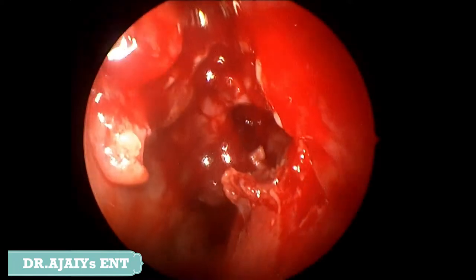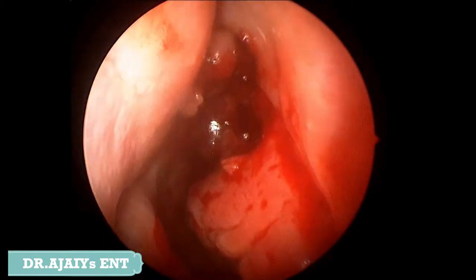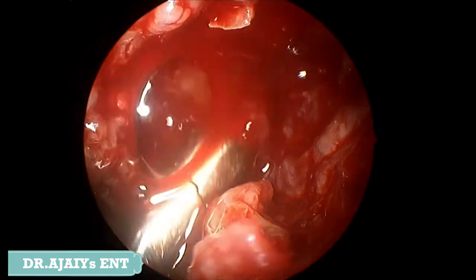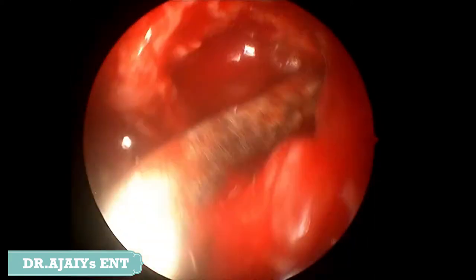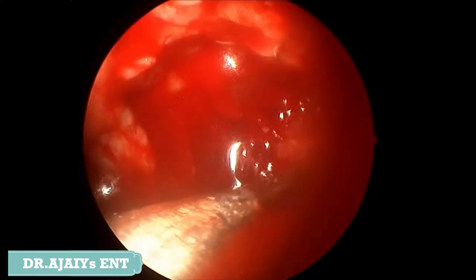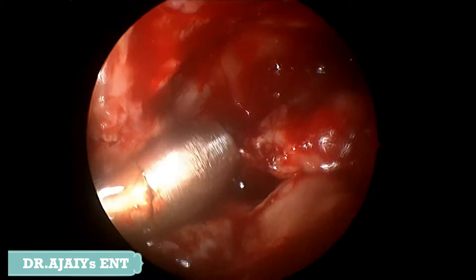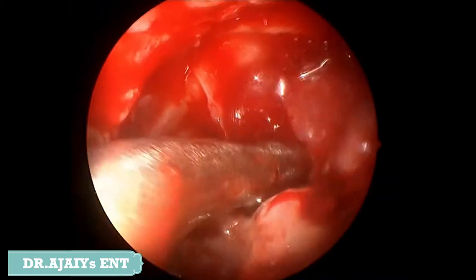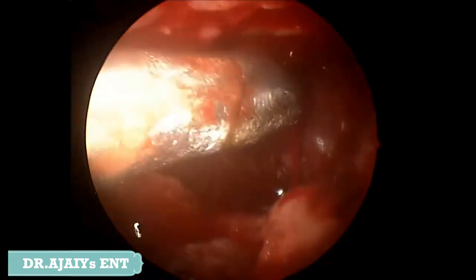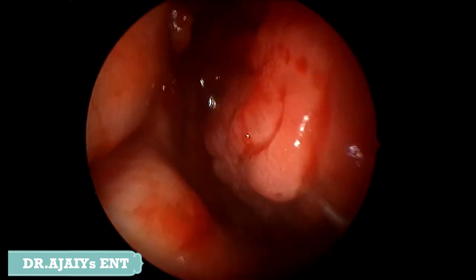The entire maxillary sinus was filled with polypoidal contents. We removed them and could see necrotic contents and necrotic fungal material along the floor. We cleaned up the maxillary sinus with a thorough washing, and we could see the necrosed contents along the floor which were indicative of fungus. Initially this appeared as a case of early mucormycosis — we couldn't find anything on endoscopy but depended on our MRI.